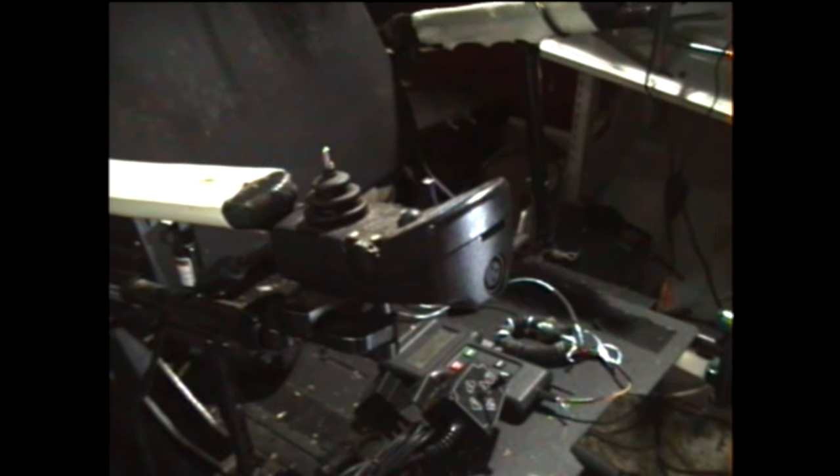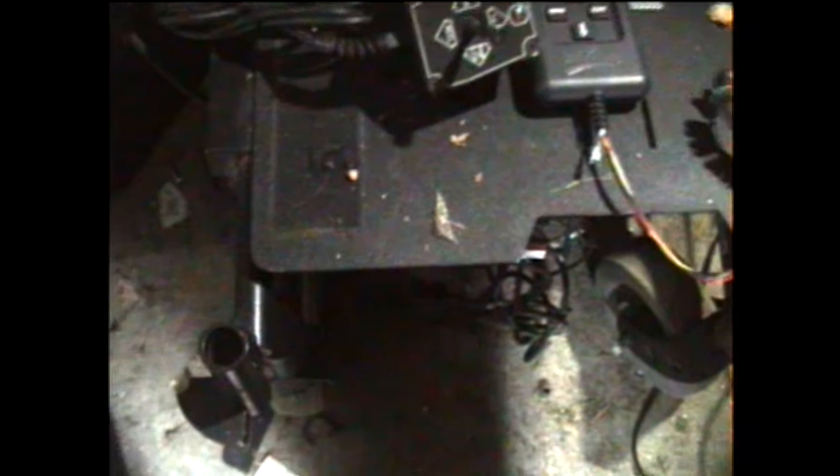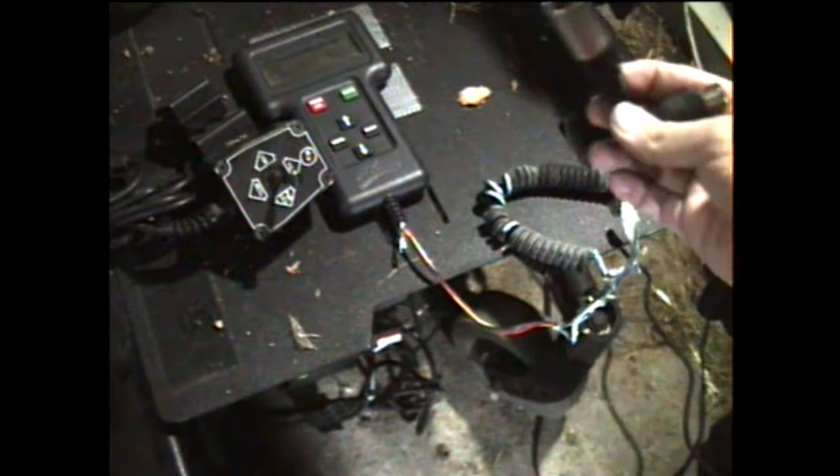Today we're going to be working on the Invacare MK6i Drive Lockout. I'm going to show you how to disable that on the older Invacare chairs. You need a programmer — actually the older kind that went on the Action will also work, as long as it has the bigger plug on it.